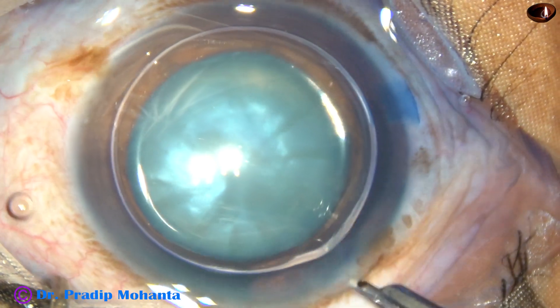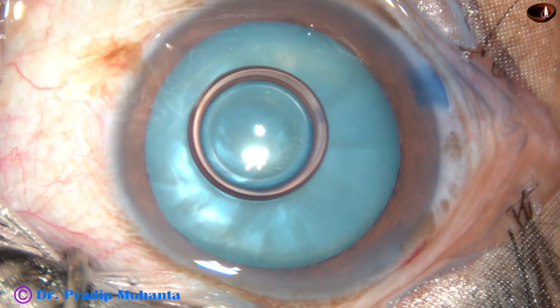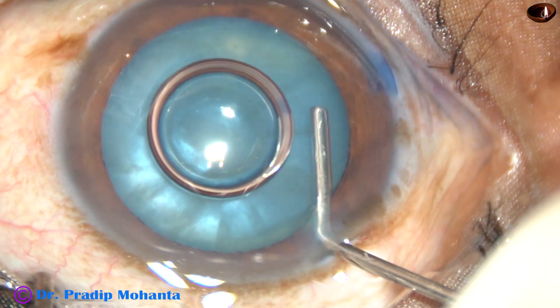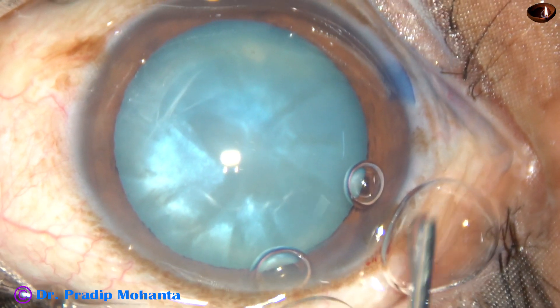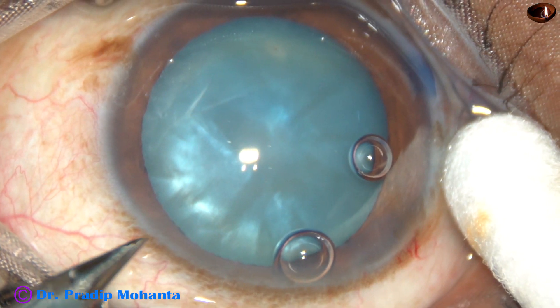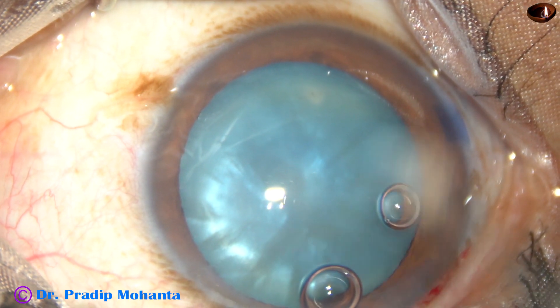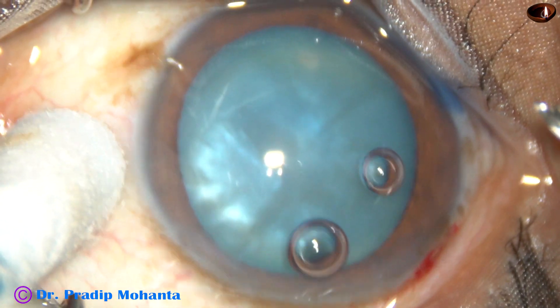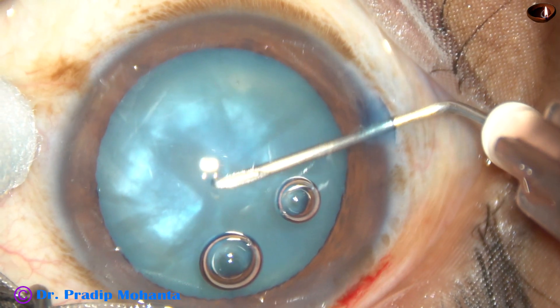Now the dye is washed out. The main challenge in intumescent cataracts is capsulorhexis. Let us see how we can do it. Visco is injected — this is HPMC, 2% hydroxypropylmethylcellulose. Now, one more paracentesis is done on the left side, about 3 o'clock hours away. A 26-gauge needle is being used to incise the anterior capsule and make a C-flap — a curved flap.